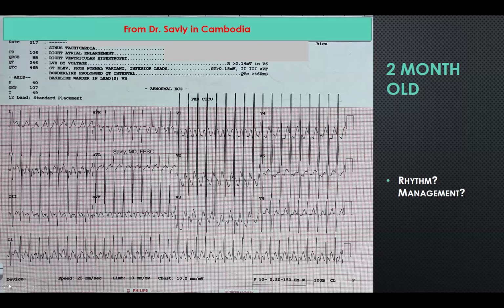Sometimes patients or patient families think they've been shocked when the defibrillator goes off, because defibrillators will often capture skeletal muscle and the patient will jump to some degree. And if you're holding a patient or doing CPR, it can feel as if you were shocked because the patient literally moves when they get the energy delivery. But that is not an electric shock to anybody other than the patient themselves. So external shock, very dangerous to be touching the patient. Internal shock, no concern at all.